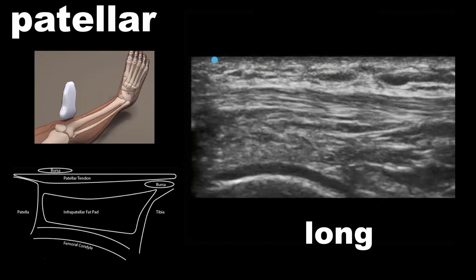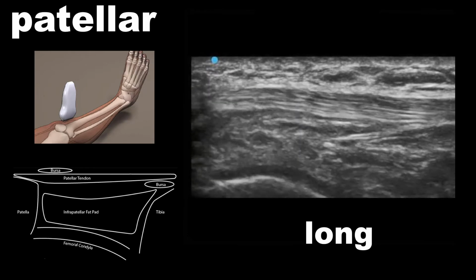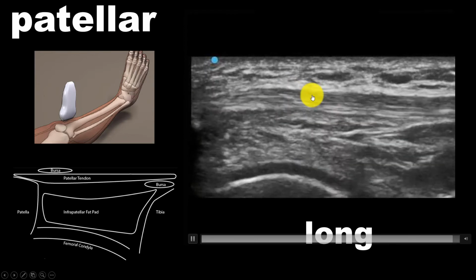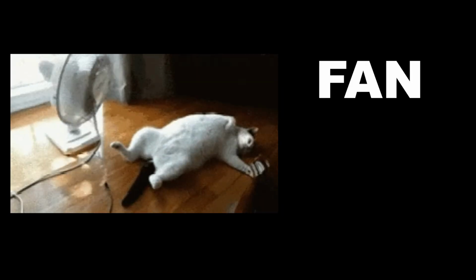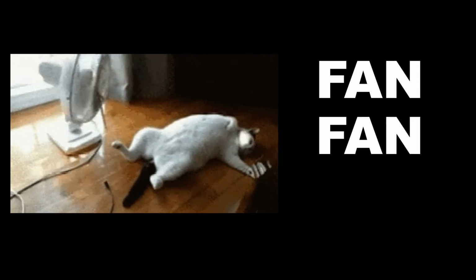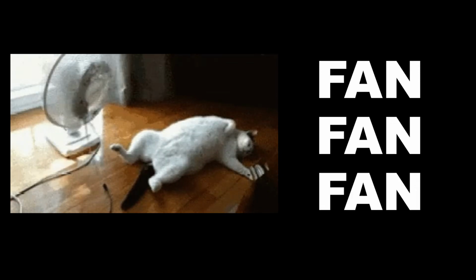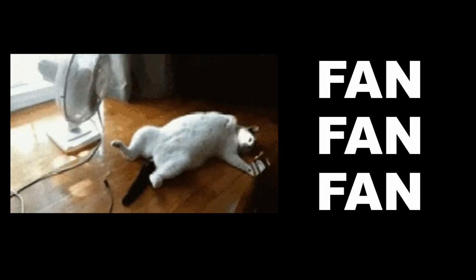Here it is again, but with the patellar tendon. Again, I'm very slightly and carefully fanning to see that the tendon changes color from a lighter to a darker appearance. Again, that is completely normal. If you think you see something like a tendon tear, bursitis, or an effusion, it's very important to do a very careful fan throughout and fan again and fan again, because the pathology does not change color, and a hematoma or a tendon tear or something like that will stay looking dark.